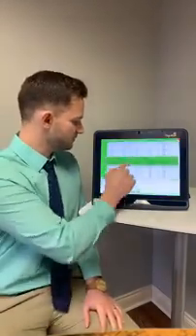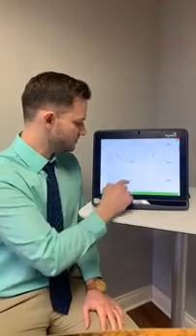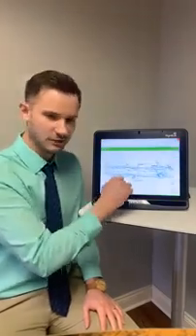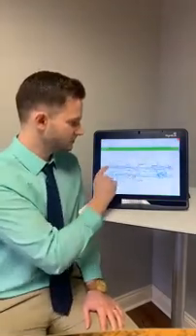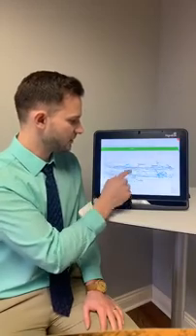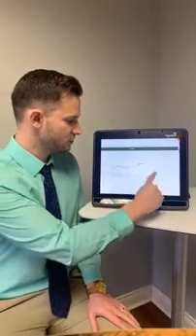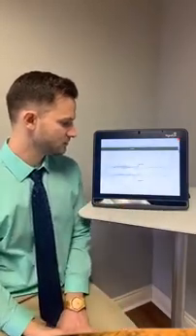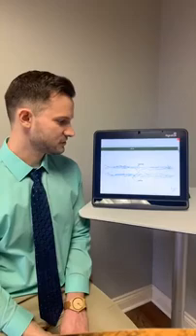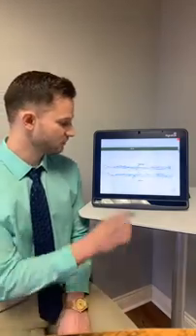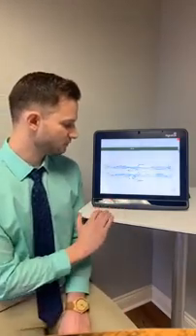These are circles. This next one is going to be horizontal pursuits, kind of like tracking right across the page. This should be, we've got the right eye and the left eye, should be able to stay right on target as the dot goes smoothly across the screen. And you can see some big jumps in there. We can see some of those fixation losses where this patient lost where the target was.